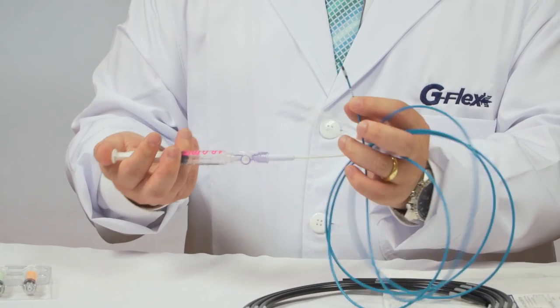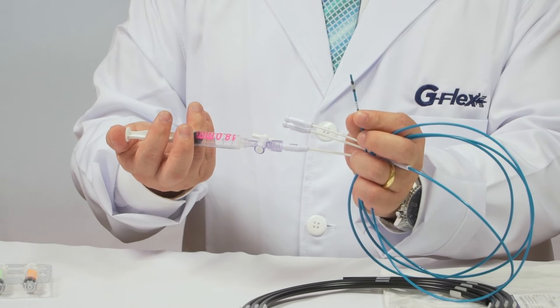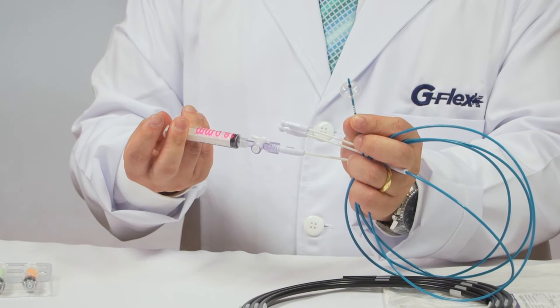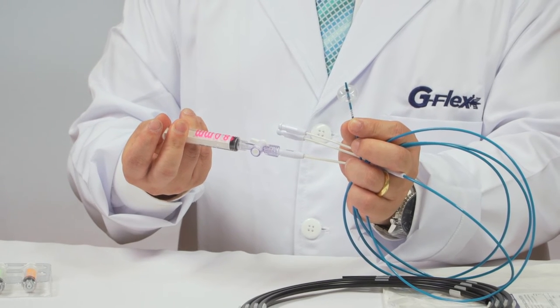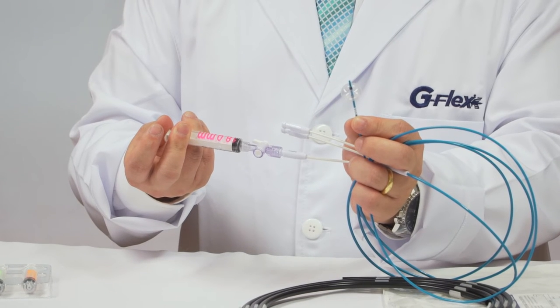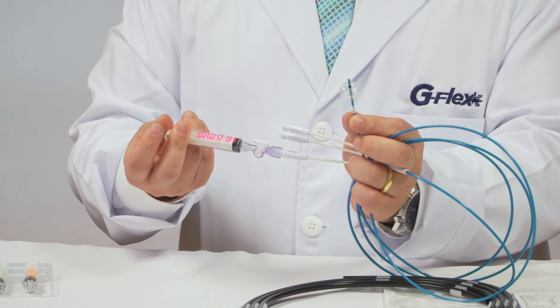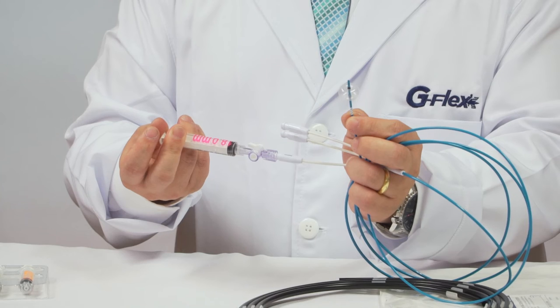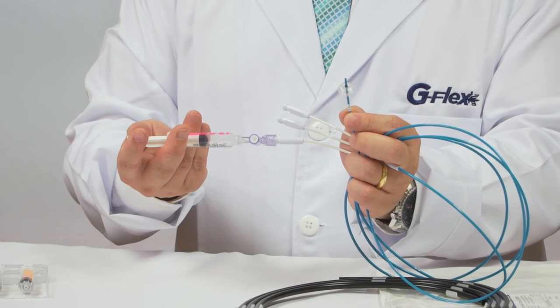You can inflate the balloon using a special syringe up to 18 mm. It's a huge size designed for special cases where doctors prefer to perform stone extraction without using conventional lithotripsy. It's very useful.